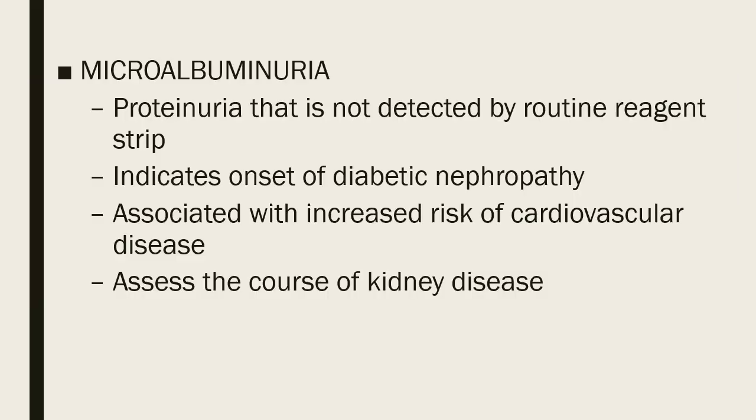And then, of course, you have your microalbuminuria. Microalbuminuria is a condition that is characterized by the presence of a slight increased amount of albumin in the urine. It is a proteinuria that is not detected by routine reagent strip testing.